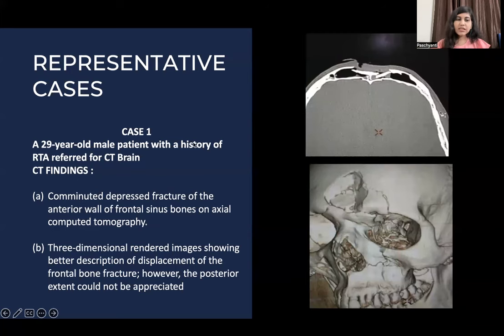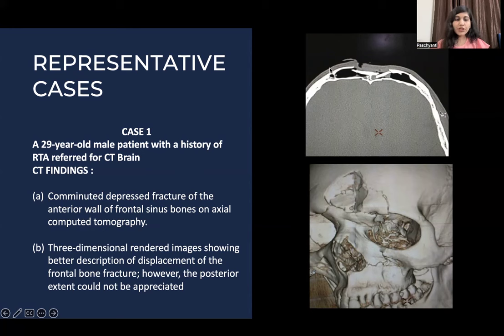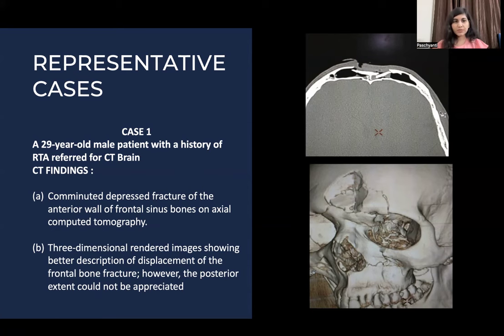Case 1: A 29-year-old male patient with a history of RTA was referred for CT brain. Comminuted depressed fracture of the anterior wall of the frontal sinus bones is seen on axial CT. The 3D rendered images show better description of the displacement of the frontal bone fracture; however, the posterior extent could not be appreciated.